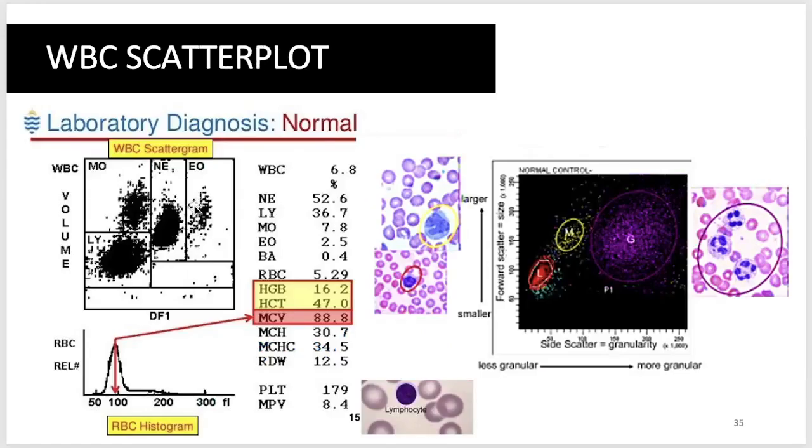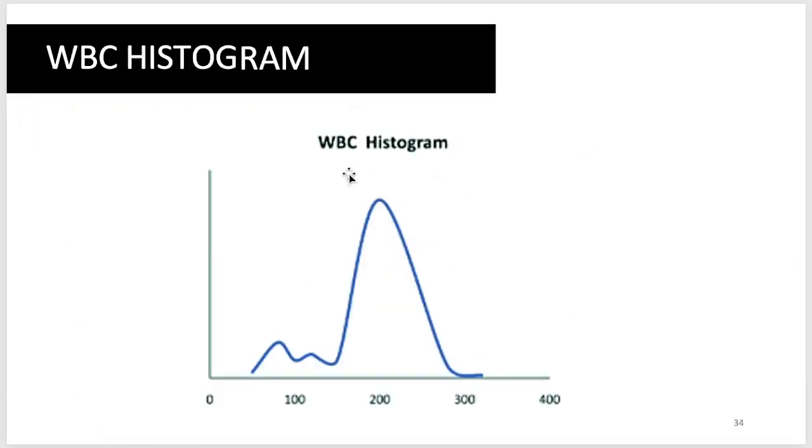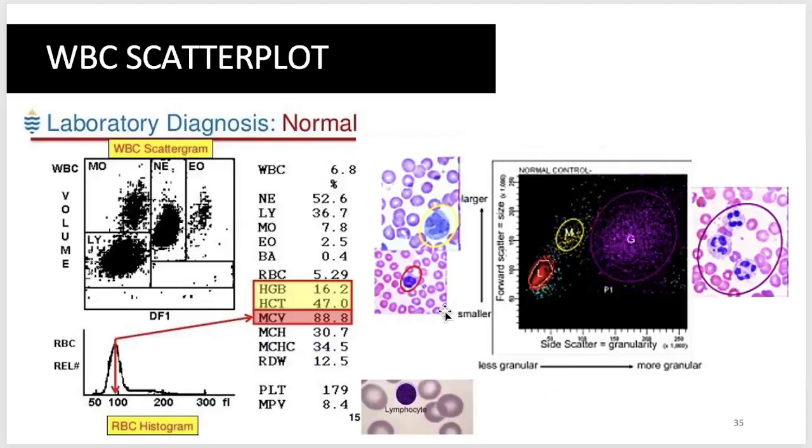Pero usually, ang doctors hindi naman tinitingnan talaga ang mga diagrams kasi we just look directly at the result, kasi mai-interpret by just knowing the normal range. Lymphocytosis to, mataas siya. But it's just nice for us that we all know how to properly interpret your histogram. So, meron din tayong tinatawag na scatter plot.